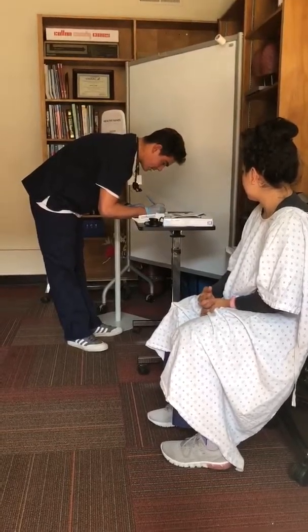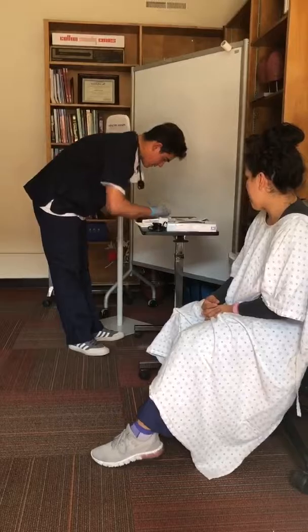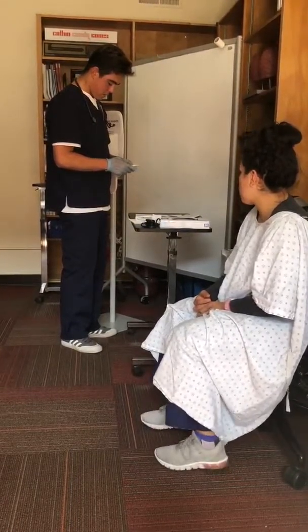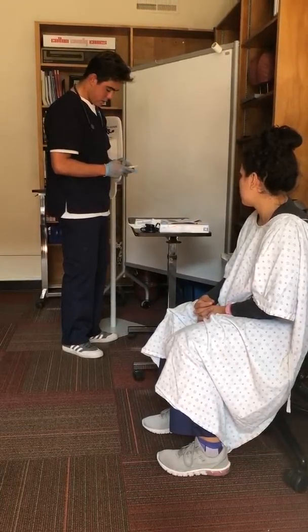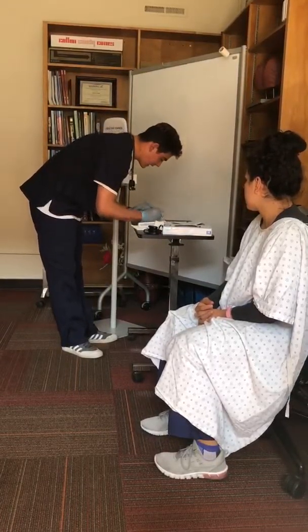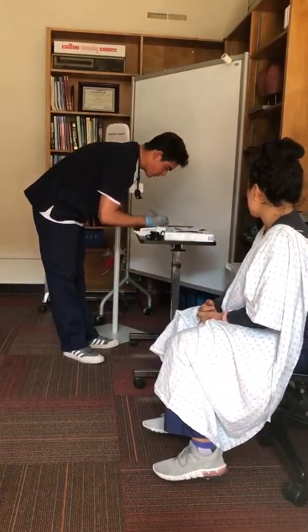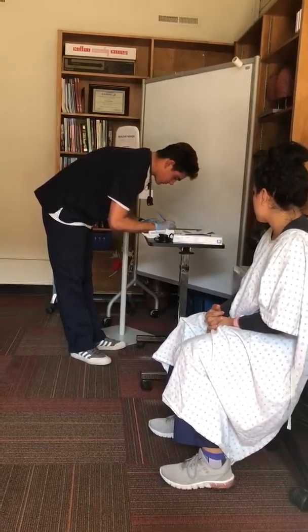So we're going to do 410 divided by the 418 times 100. A little bit of math. So we're at 98% of the predicted, so that's a very good job. And then we're going to compare the pre and post results.